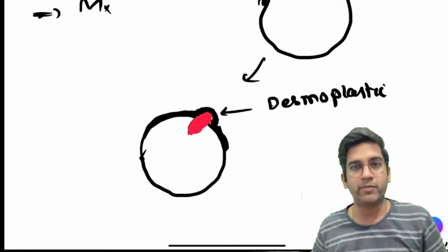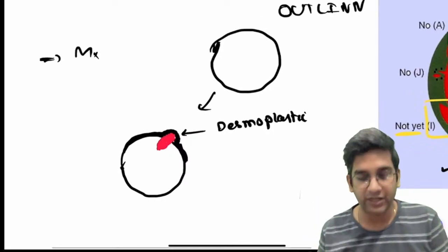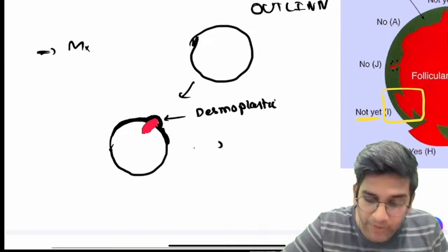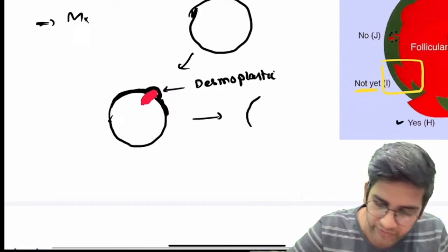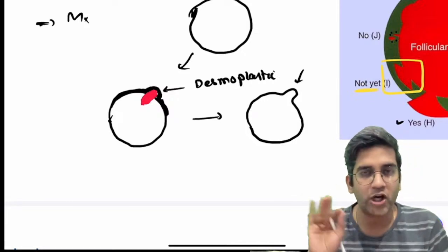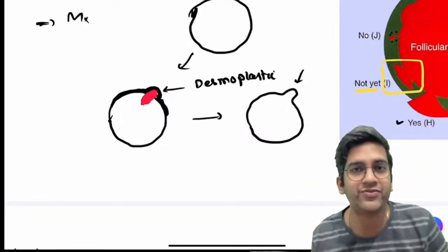Now then I have a problem again. Is it looking inside the capsule or has it gone outside the capsule? That's where my capsular outline will help. Let's assume that I am not able to differentiate desmoplasia and the capsular invasion. Imaginarily removing the tumor, the outline will become like this. Do you think this projection is normal or abnormal? Is this capsular outline normal or abnormal? It's abnormal. A capsule cannot poke in ways where I want.